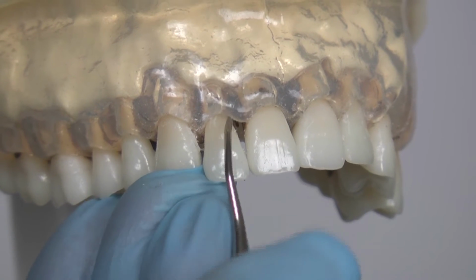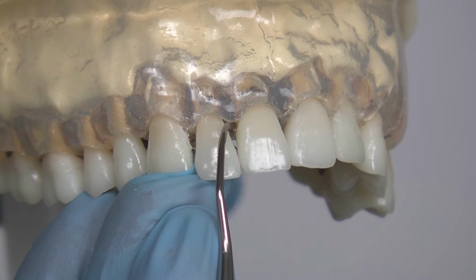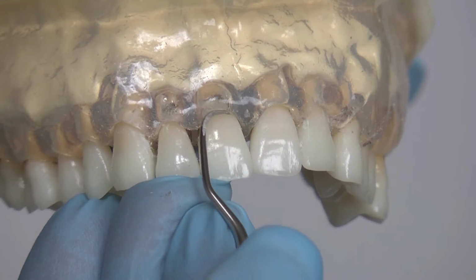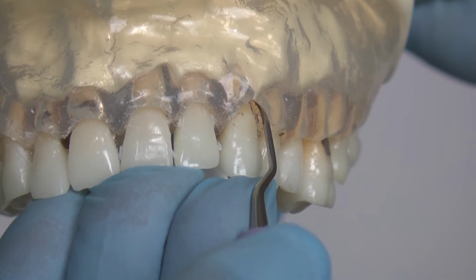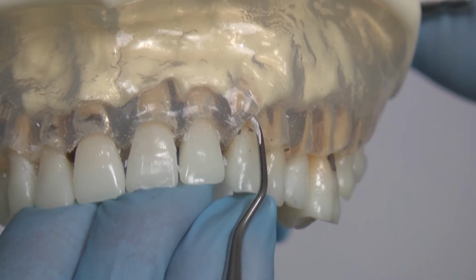The most efficient way to complete a scaling procedure on the selected teeth is to scale all surfaces, either towards or away from the operator, using the same working end. Then, apply the opposite working end to complete the scaling on remaining surfaces.